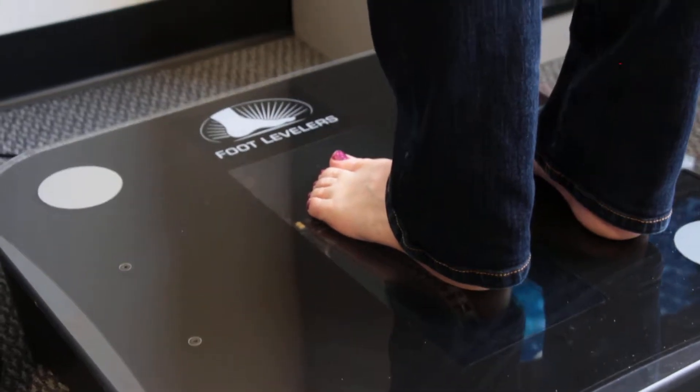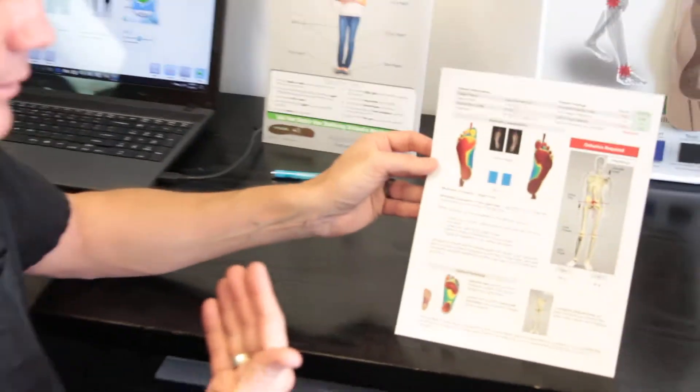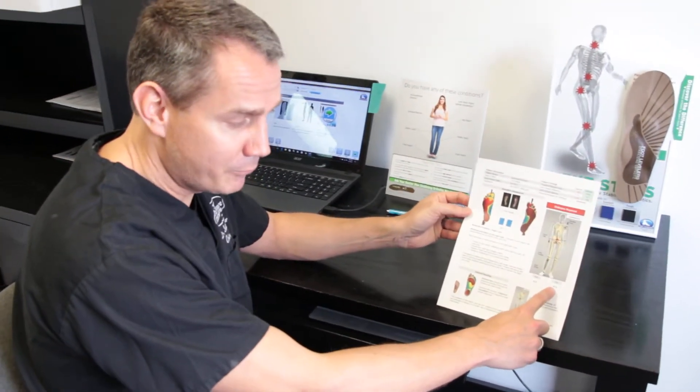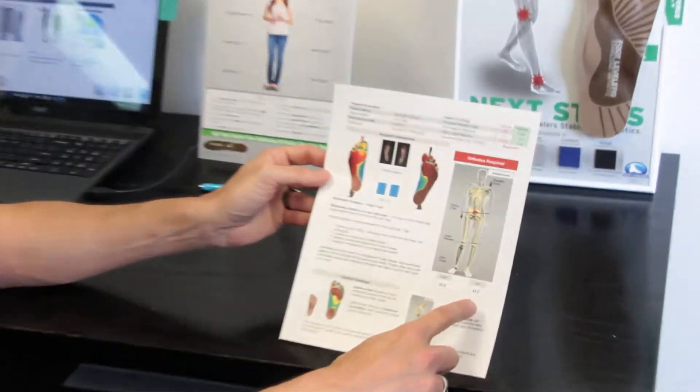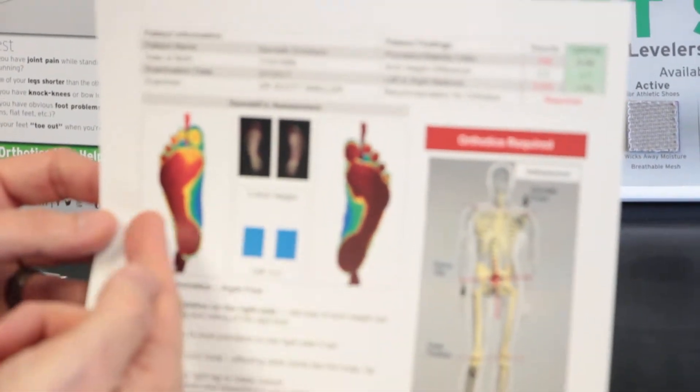When the scan is complete, it enables us to print out, for the patient's benefit and ours, exactly how much more weight bearing — 52% as compared to 47% on the right versus the left — and by color, how much more weight bearing they're having on one foot versus the other.